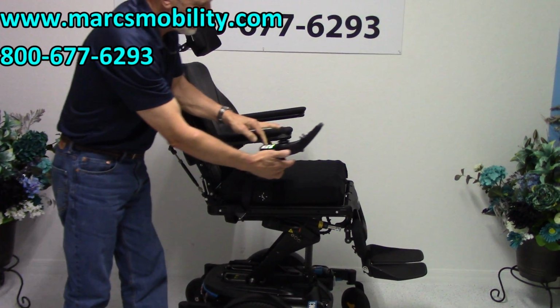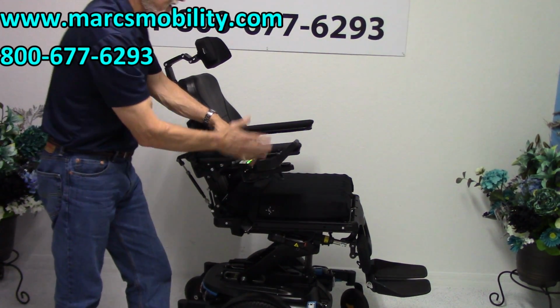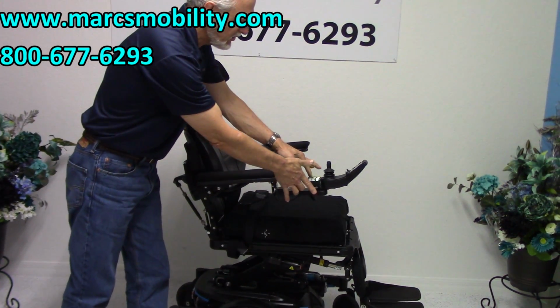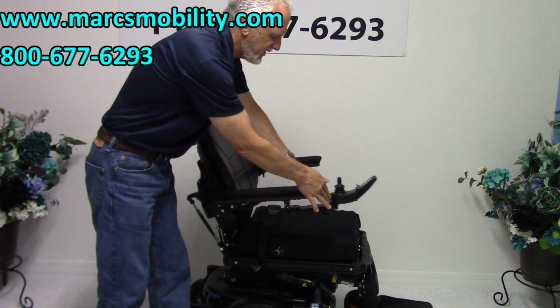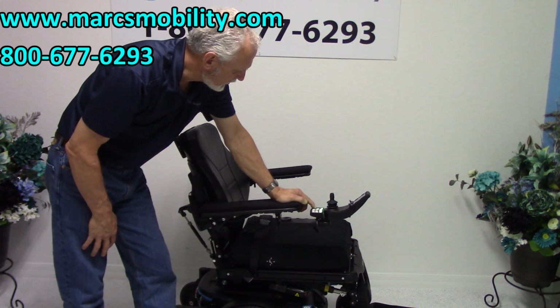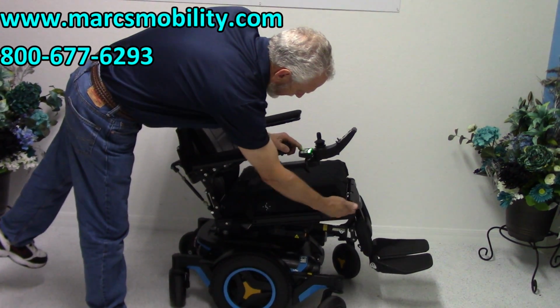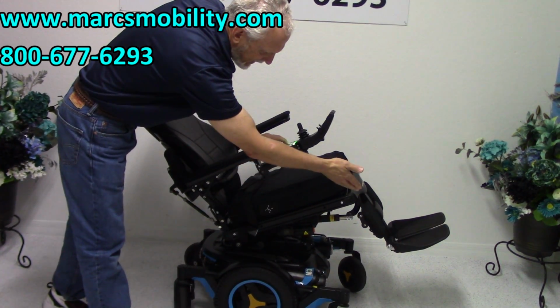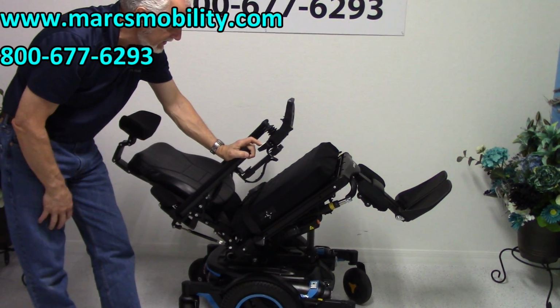Also with this chair, you've got what's called a swing-away joystick. So if you want to swing the joystick from the front to the side so you can get to a table closer, everything is set up on the right-hand side right now, but if you're left-handed, we can switch the joystick to the left side with no problem, and the joystick would swing over to the left side, okay? So the next function we're going to show you is called the electric tilt. The electric tilt is when the bottom right here goes back. So when this goes back, of course it's going to take the legs and it's going to take the back with it because they're all connected. That's called the electric tilt.